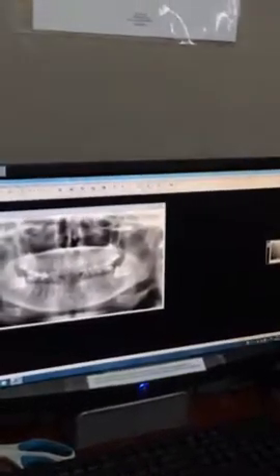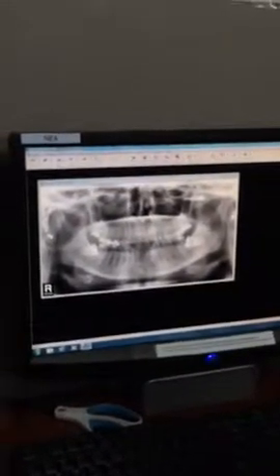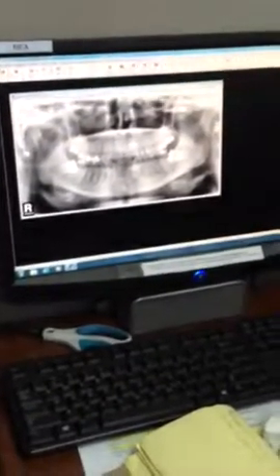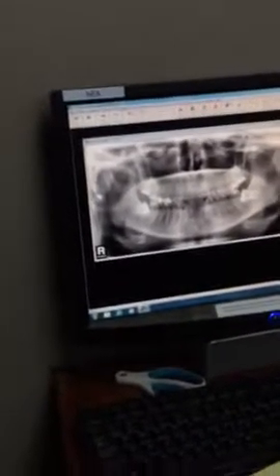One reason it's a little bit lacking contrast is that I had the lowest power setting on it, the setting for woman and child. I had the lowest power setting, and I'm fixing that.